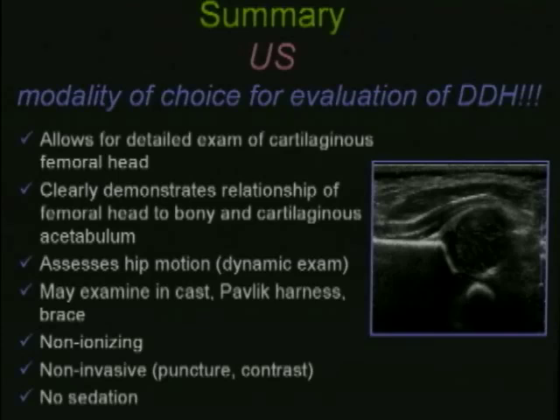Of course, if the baby is in a cast, a window has to be cut out of the cast to gain access. During the Pavlik harness, it's quite easy to examine the baby, and a brace certainly can be removed to examine the hip. It's non-ionizing, it's not invasive, and no sedation is required.